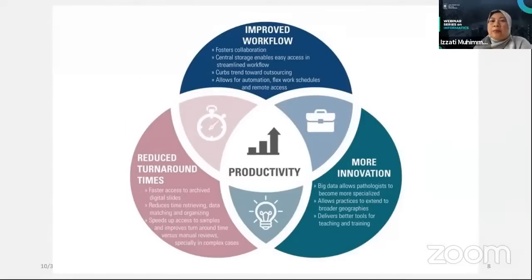In that case, the pathologist may not be able to decide what level or what stage the cell is at. So the pathologist will ask the laboratory to make a new sample from that patient. That will happen if we use manual glass reading, and that process will take time, and it needs to be transported. It will take some more time.